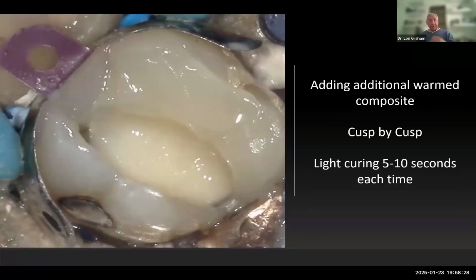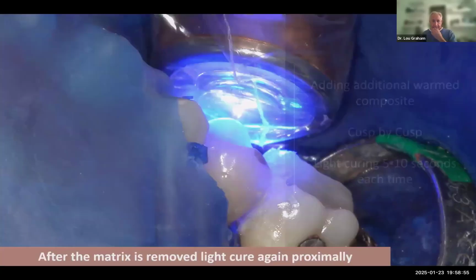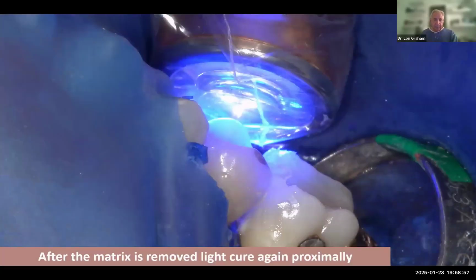And then what I would do is I would add a little bit of warm composite on the lingual cusps, then the buccal cusp, minimizing my C factor. So I like going cusp by cusp, shaping each cusp. I don't believe in tertiary staining. I just don't do that. And I light cure each cusp 5 seconds, so you have minimal C factor pulling. So one cusp at a time, lingual first or the buccal first, and then going the opposite side. After I remove my matrix, I like to still cure interproximally.